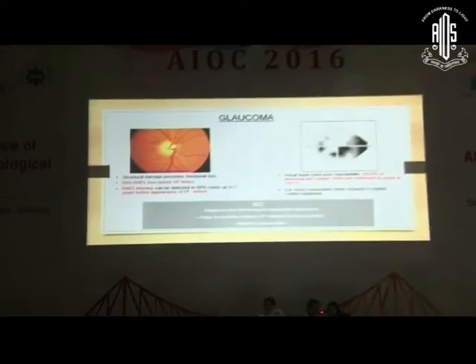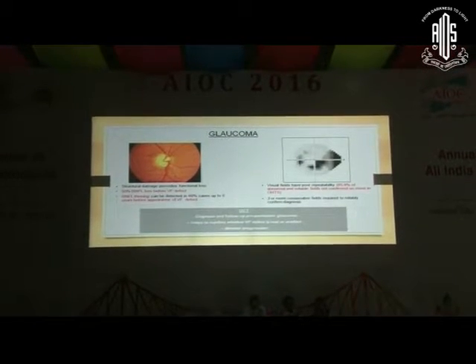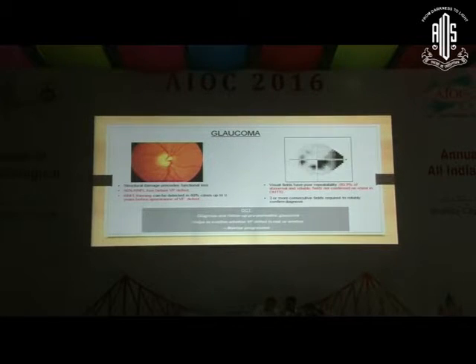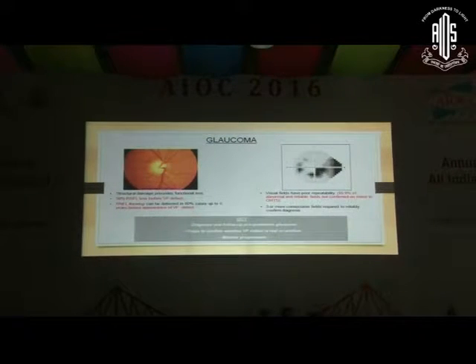And I'd like to begin with this very basic fact that though visual fields are the gold standard for diagnosing and managing our glaucoma patients, we must remember that structural damage precedes functional loss, and 50% of RNFL loss may take place before a visual field defect is apparent. Also, RNFL thinning may occur up to 6 years before a visual field defect appears.